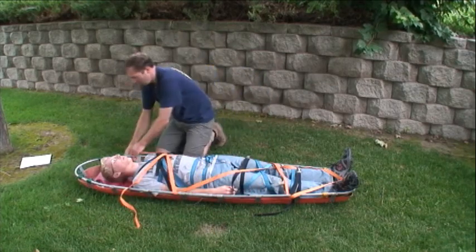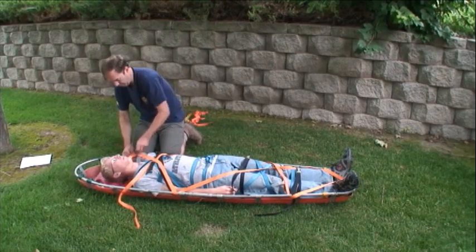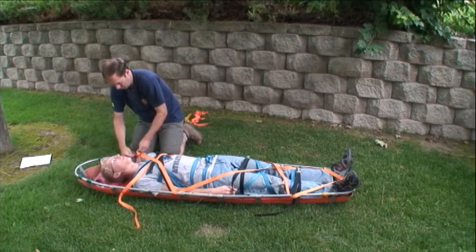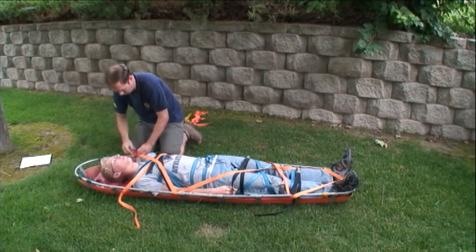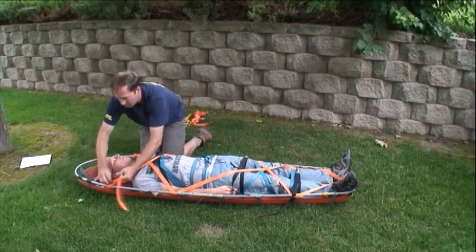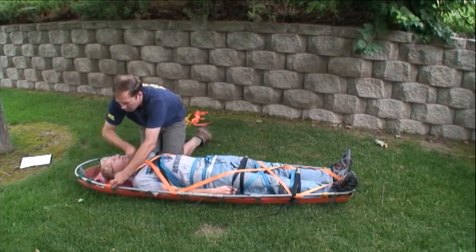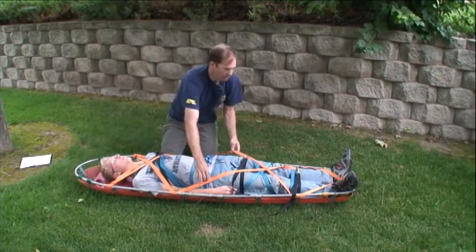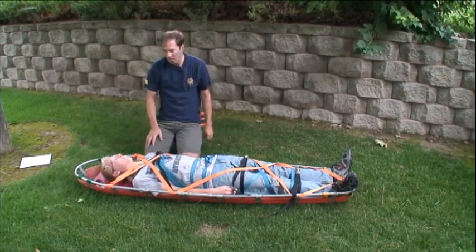In this case, I do my crisscross over the knees and the chest, which might be a good plan if there's a hip injury and you don't want to crisscross over something tender. In the next example, you'll see I cross closer to the waist and torso, which gives a much more secure lashing. But either way, your patient's tied to the backboard and with a couple of crosses, he won't come out.